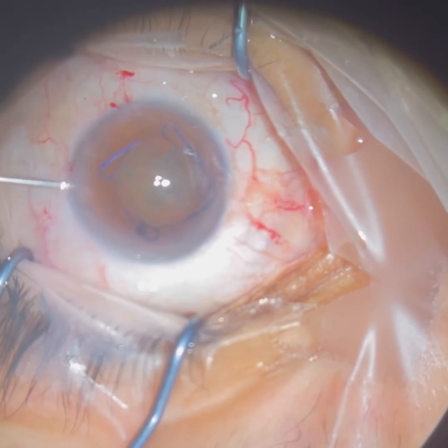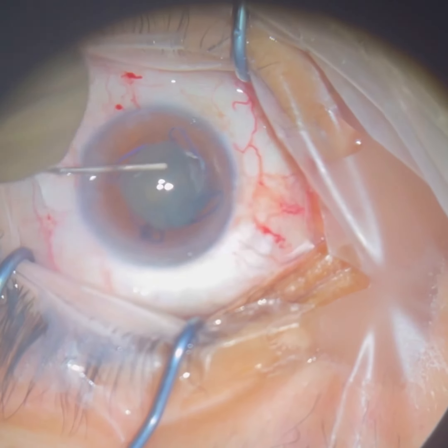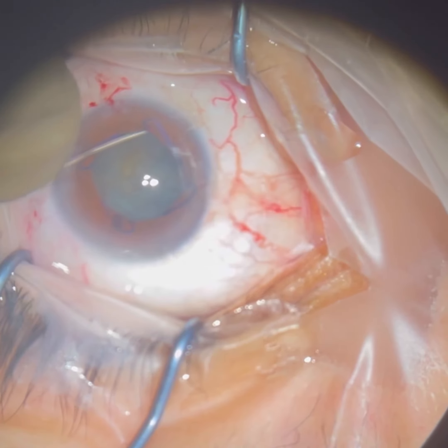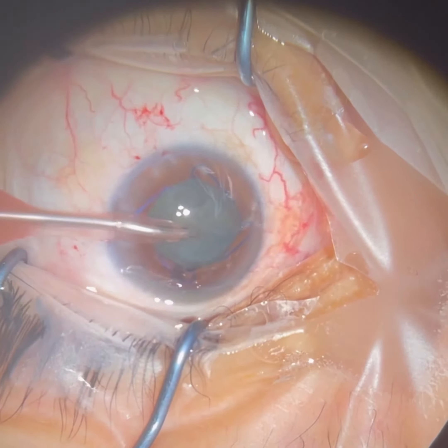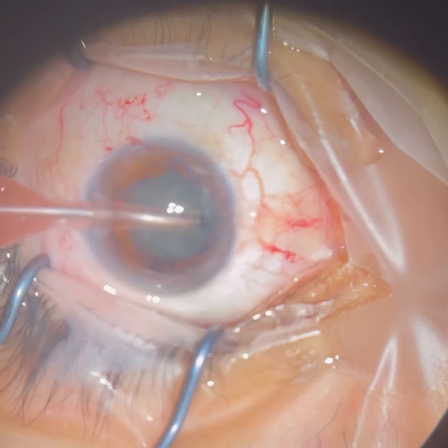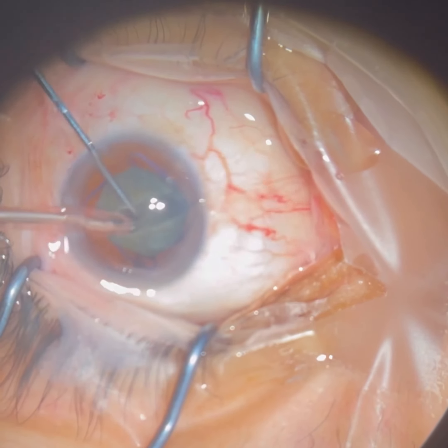So we've opened up the capsule, and now we're hydro-dissecting — basically hydrating the lens so that we can safely move it within the bag, which is the capsule that holds the old cataract and will hold the future new clear lens in place.